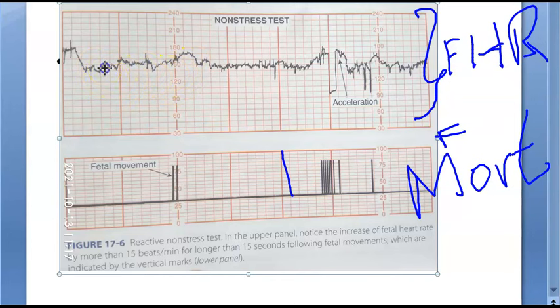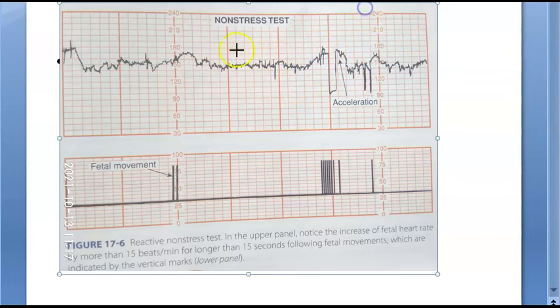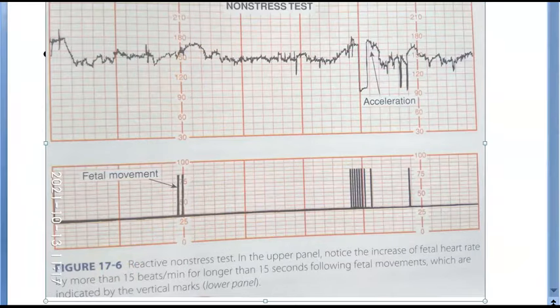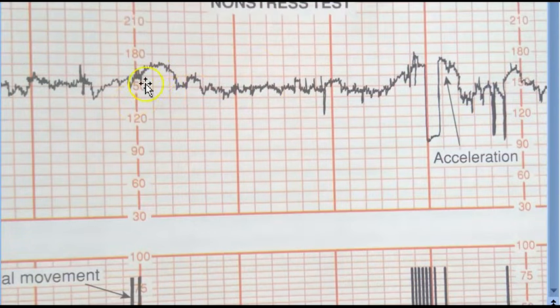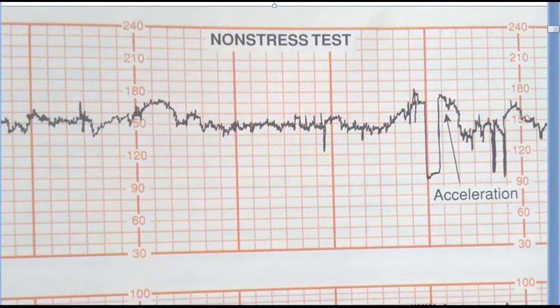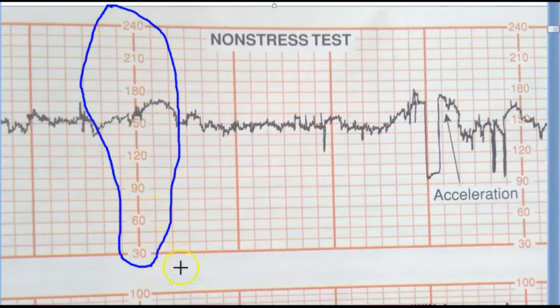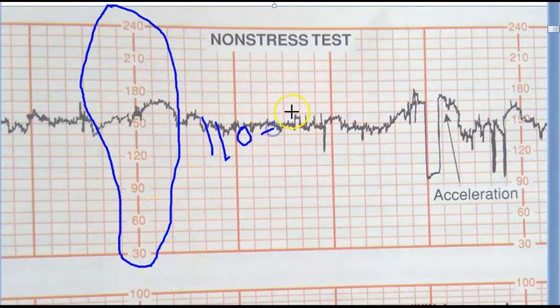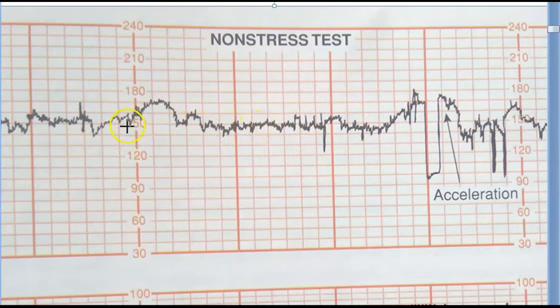The fetal heart rate is oscillatory — it keeps changing. Your heart doesn't beat at exactly 150, 150, 150 — there's variation. There is a variable heart rate that goes up and down. This is what the textbook calls oscillatory. The fetal heart rate is plotted with a maximum of 240 and a lower limit of 30. Usually the fetal heart rate is 110 to 160, and here it's around 150 — that's the baseline.